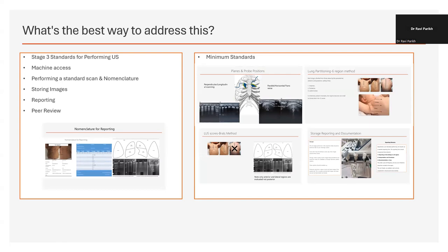But more importantly, what you have to address is how you're going to store those images and reporting. They must always be stored as loops. You need to be able to see sliding and dynamic air bronchograms.